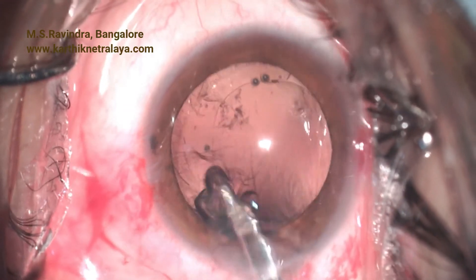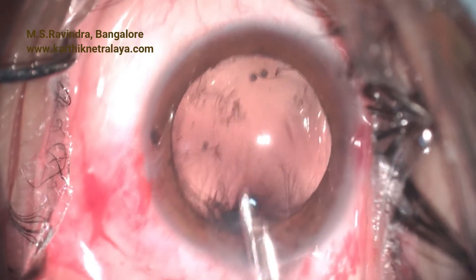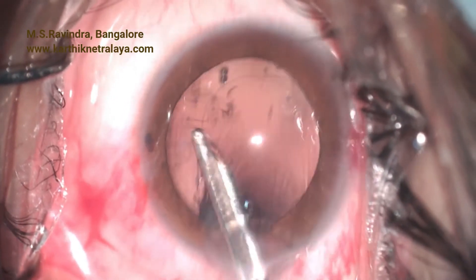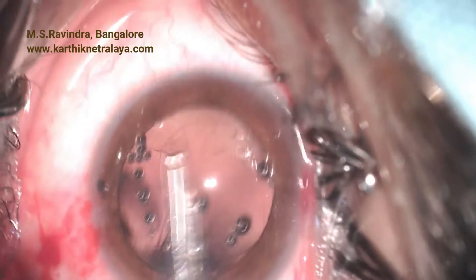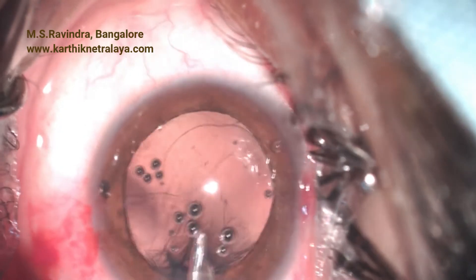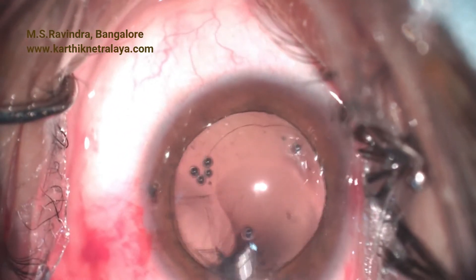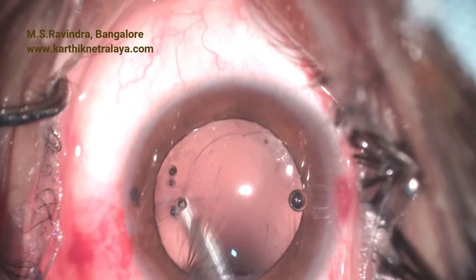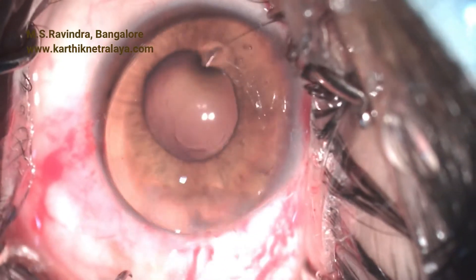It's a low-pressure technique — at no point does the pressure go above normal intraocular pressure. The irrigation infusion is controlled by visual feedback from the microscope. Note that phacoemulsification is not needed for this surgery, and irrigation and aspiration is controlled manually.